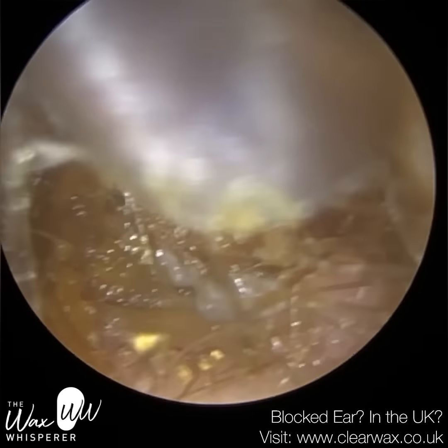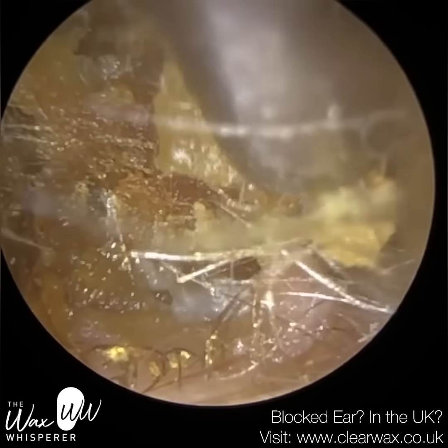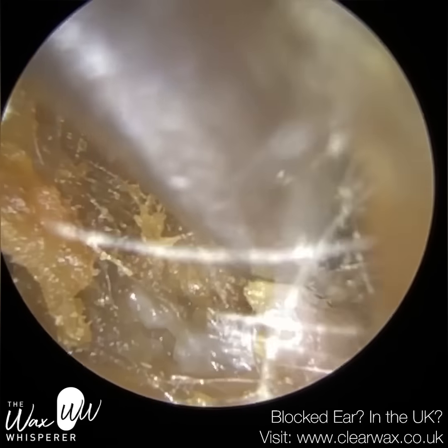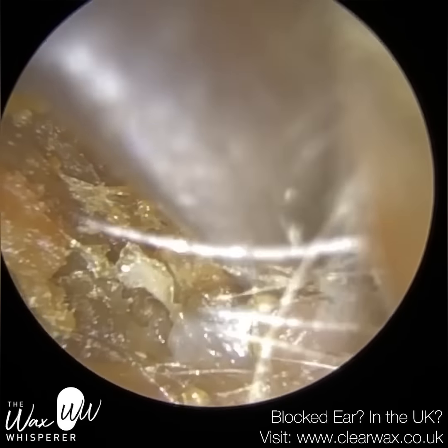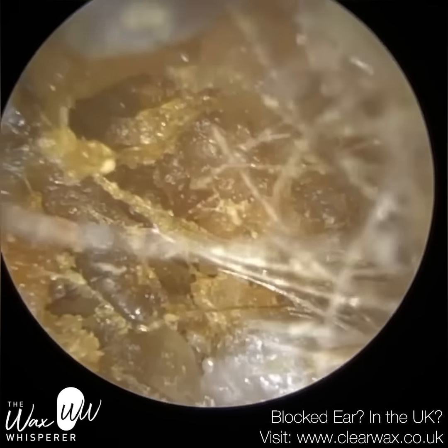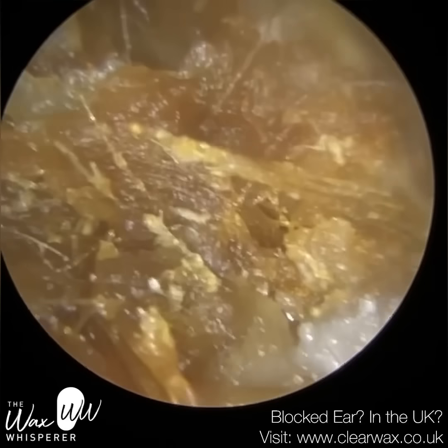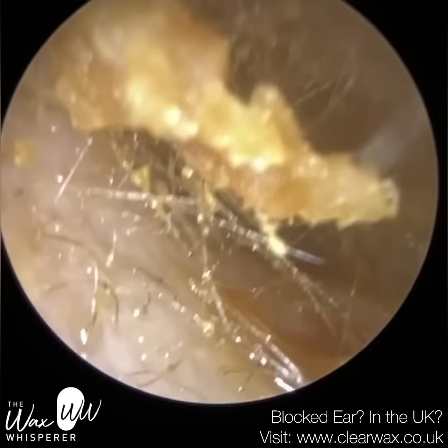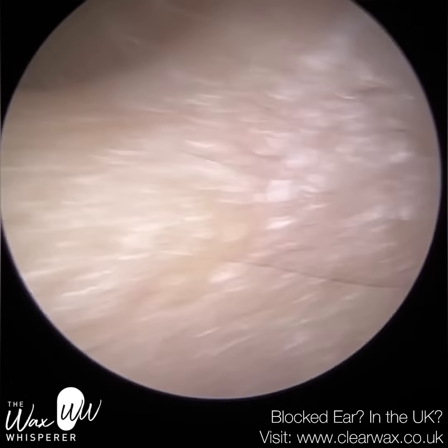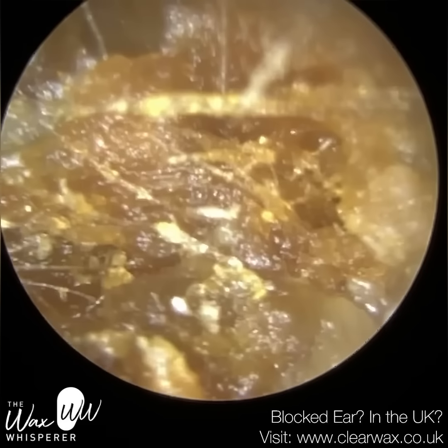When you have a crater created because of the loss of bone, the skin that lines the ear canal can dip, and you get a huge widening. This patient's got a massive crater. You'll see it in a moment. It's absolutely humongous, and you've got all this dead skin invading this crater. Another way to look at it, you've got a pothole on the road. There's a big indentation on the road itself. So this patient's got an indentation to the ear canal.